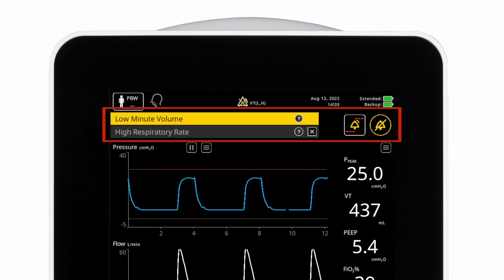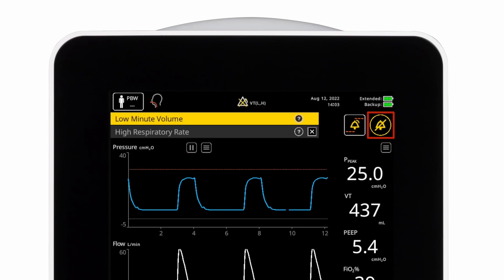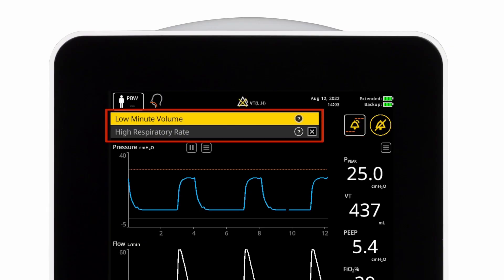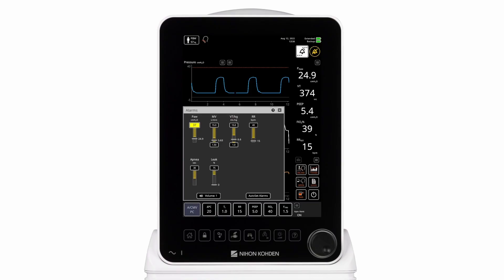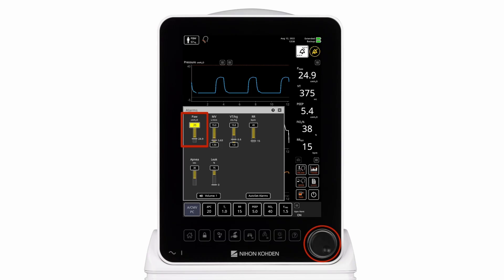The alarms area contains the audio pause button, the user adjustable alarm settings button, and the alarm messages area. When setting an alarm, the clinician presses the alarm settings button, selects the alarm for adjustment, makes the adjustment with the encoder knob, then confirms the adjustment by pressing the encoder knob.